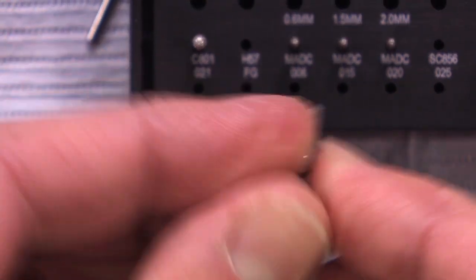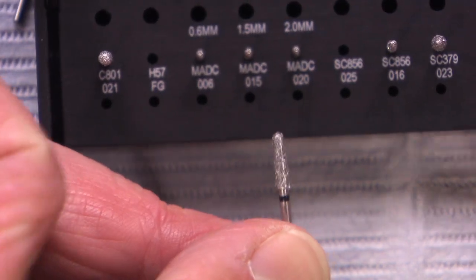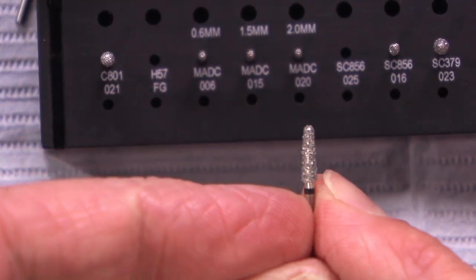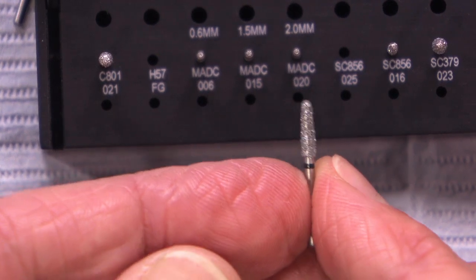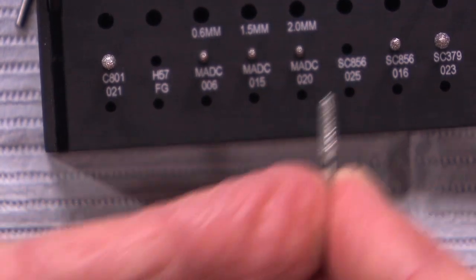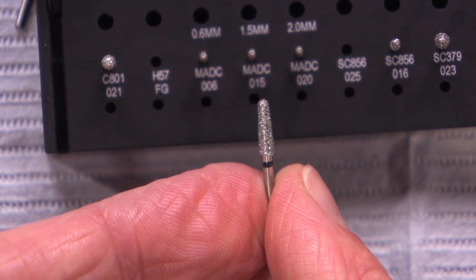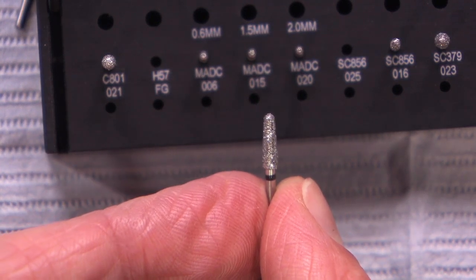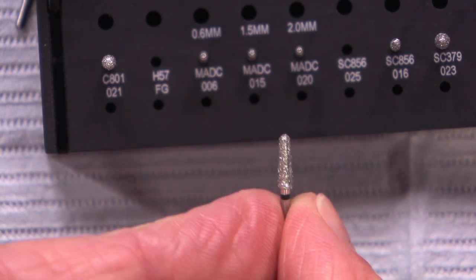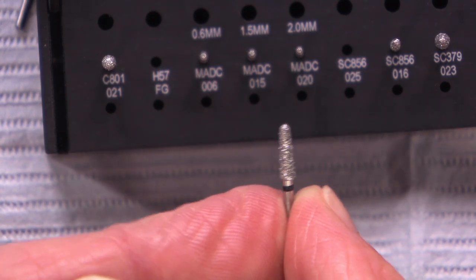As you'll see in the technique, this 856025 burr is going to be the workhorse of the technique. It's going to do most of the tooth removal. Once we put the depth cuts in, we're going to connect everything with this. You can see it's a super coarse. You can see where it says SC on the burr kit and the black stripe there. And you can see how big those particles of diamonds are on the burr. And so it's going to remove tooth structure rather quickly. As a result, we're not going to get a lot of buildup of heat on the tooth, but obviously we still use it with water.